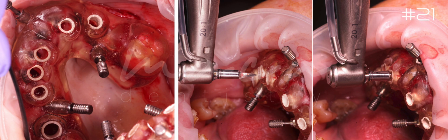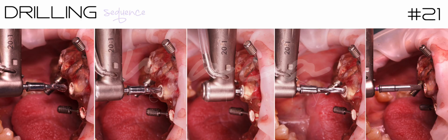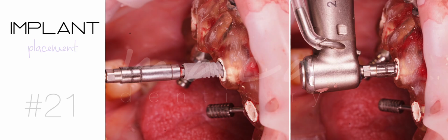As you can see in the image on the left, the guide is in position with the molars still in place, and as I said before, I like to drill one implant at a time and place it to be sure that I achieve enough primary stability. This is especially important when you go for a full arch prosthesis. So this is the drilling sequence, as you can see, here for the implant on the 21, and here the implant placement.